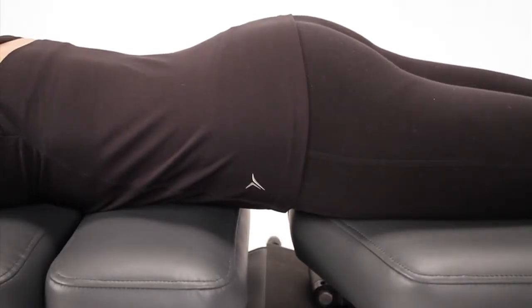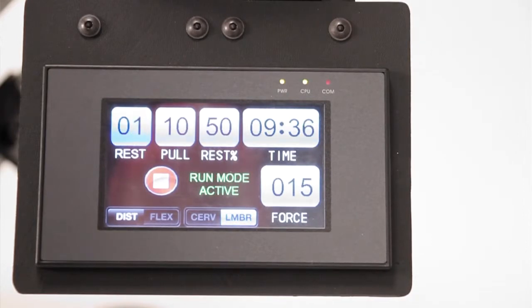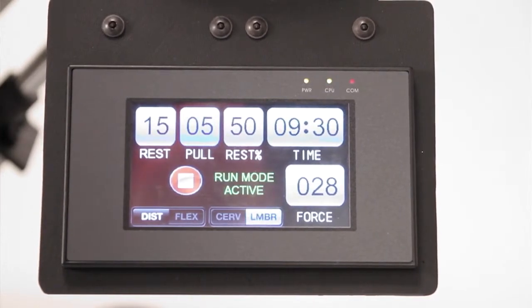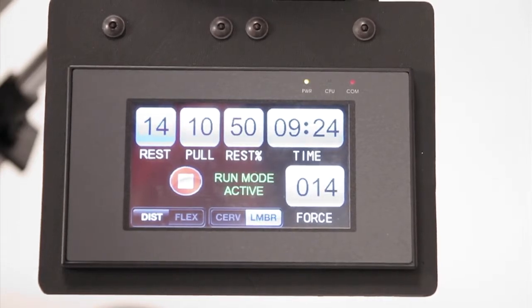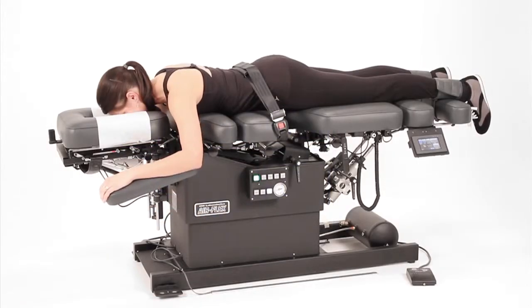Your patient will now experience traction that is smooth and consistent. During a treatment, all of the settings on the touchscreen will display actual values in real time, so you can monitor what is happening when it is happening. For first-time patients, it is suggested to use manual mode to distract and palpate your patient to determine the right amount of force needed. Pressing the Run button from there will use the desired amount of force as the maximum setting.